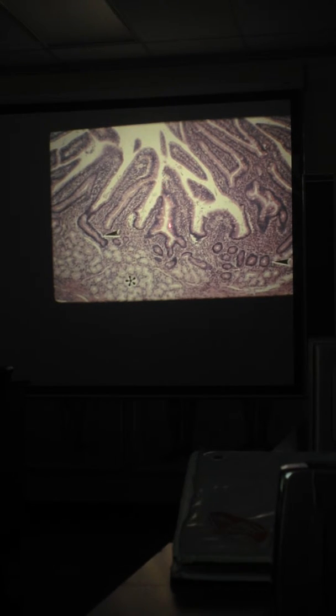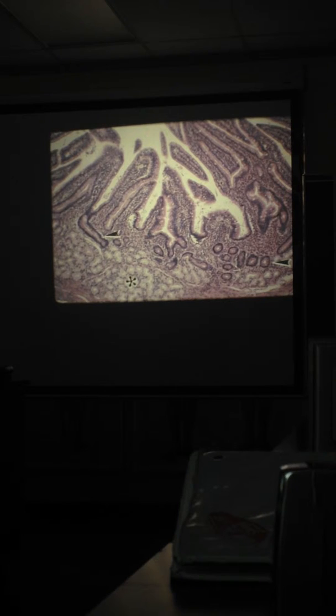So that now you have to keep in mind that you've got a lengthwise structure that turns 90 degrees, that then gives you a cross section at the bottom, turns into a circle. This is this continuation to become this, your first example of 3D interpretation. And that's just something we'll gradually do more and more, getting the 3D assessment of various structures.